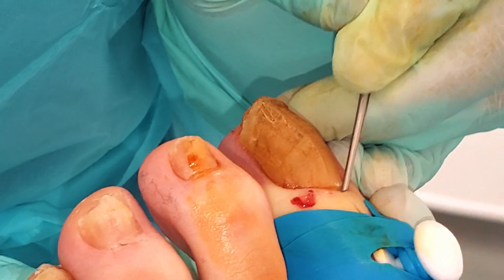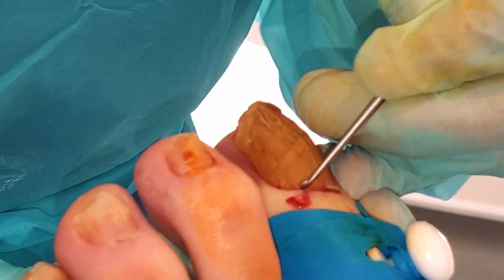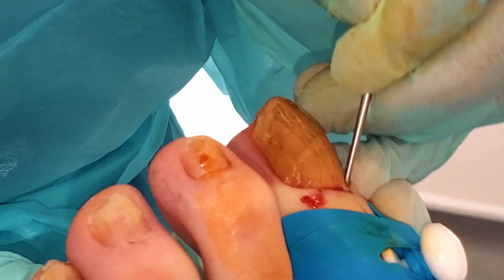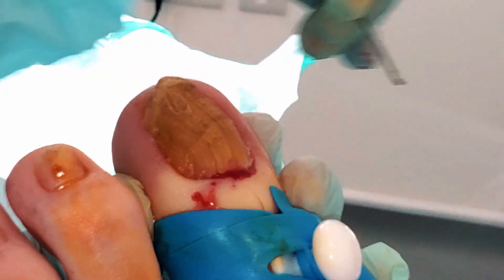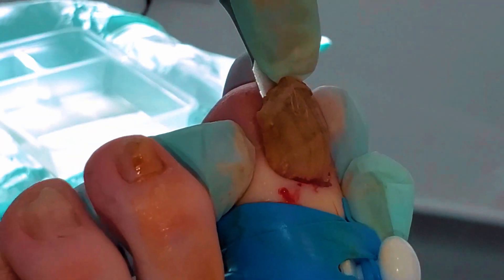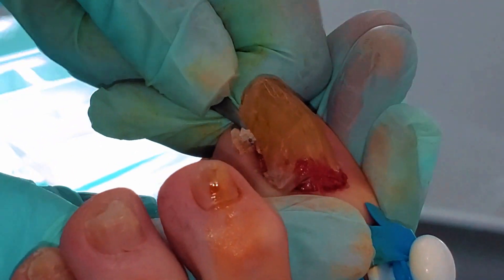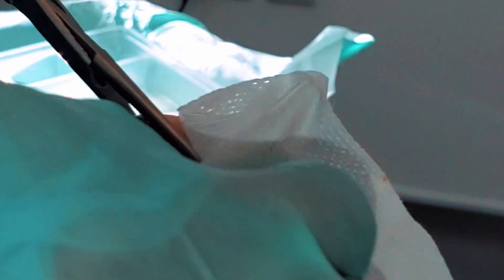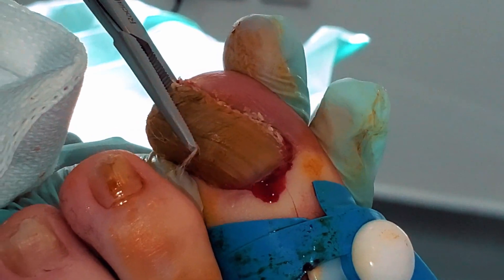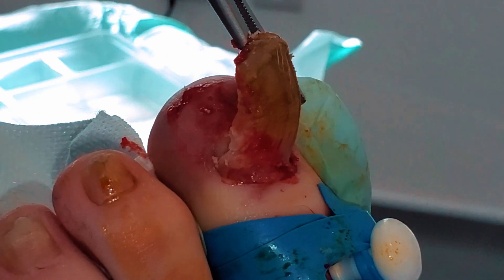You feeling okay? He can't talk. Just a nice and thick, juicy nail — it's coming out. A little bit of bleeding. That's the noise of victory.